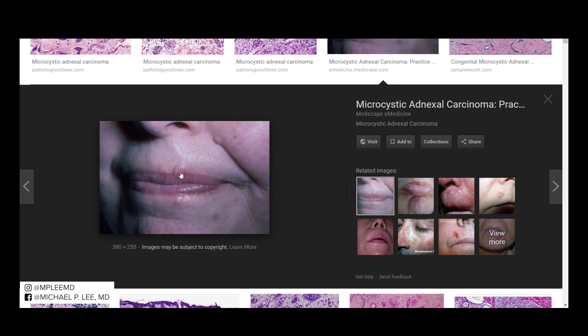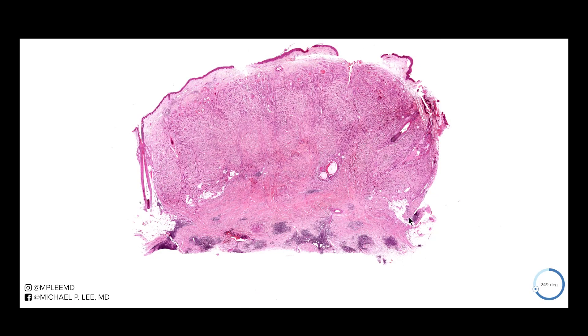Oftentimes these lesions will be shaved — a superficial shave — just to rule out a basal cell carcinoma. Let's take a look at what we see under the microscope.